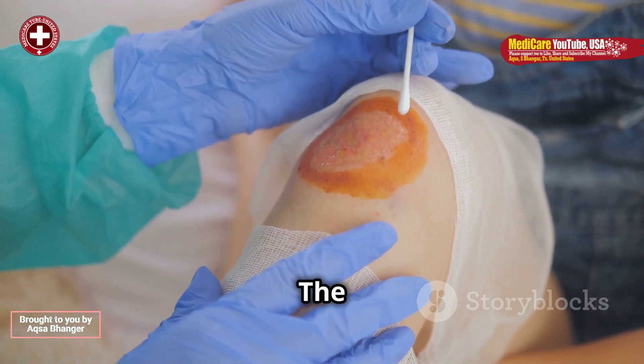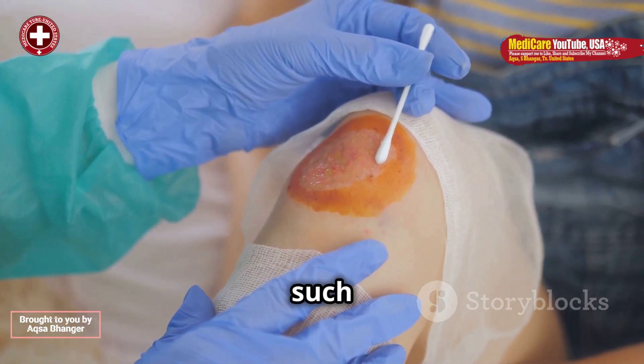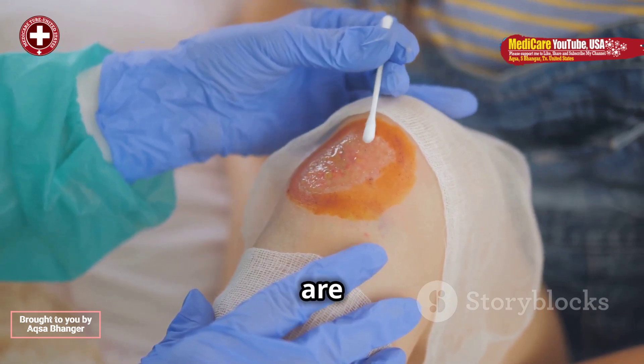Preparation. The area is cleaned with antiseptic to reduce the risk of infection. Proper tools such as tweezers, forceps, or specialized extraction devices are prepared.